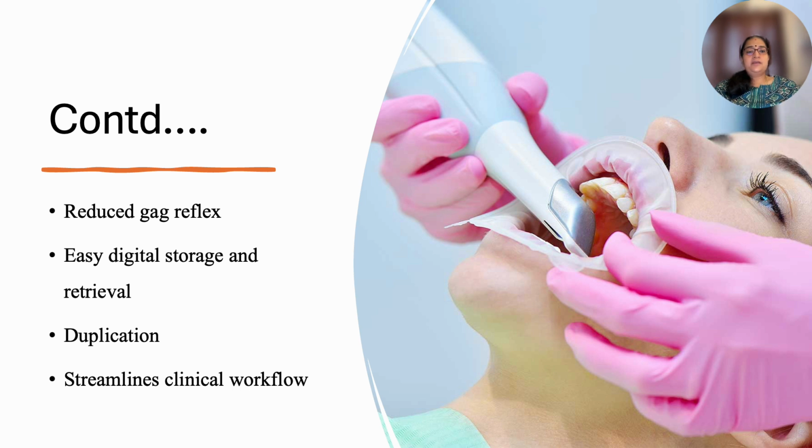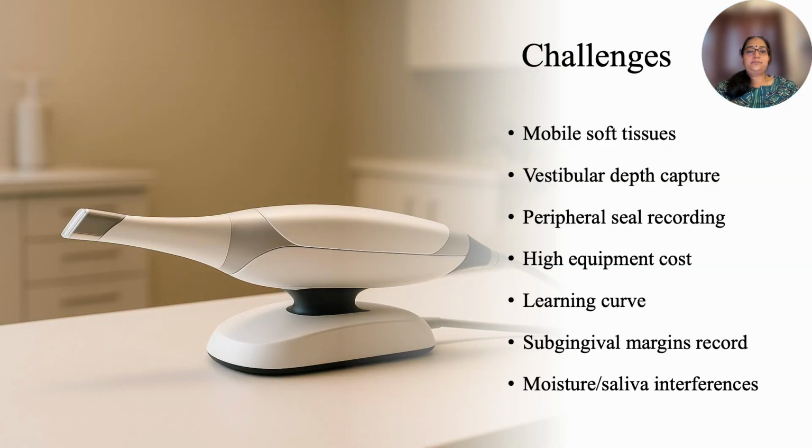There is reduced gag reflex, easy digital storage and retrieval is possible, and using the same soft copy of the intraoral scan, the dentures can be duplicated several times. The entire process seems to be a streamlined clinical workflow.